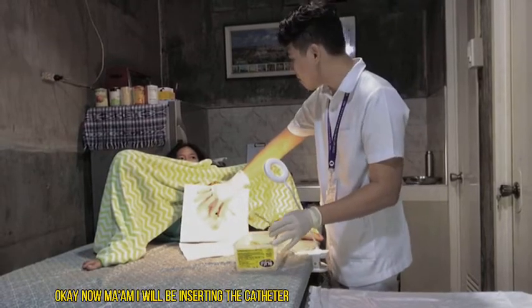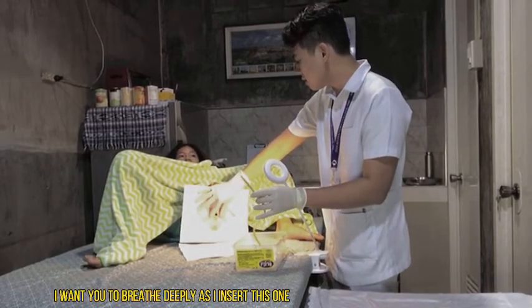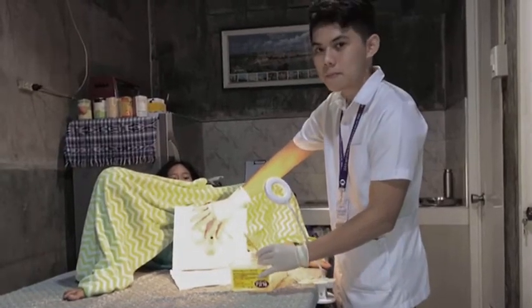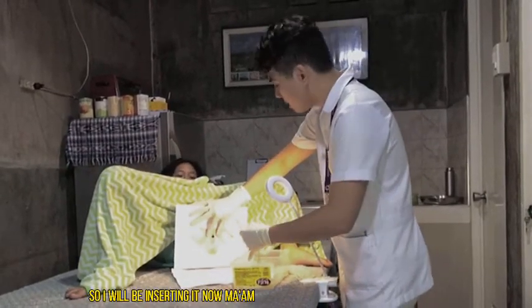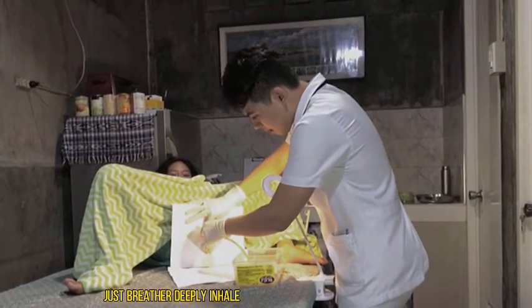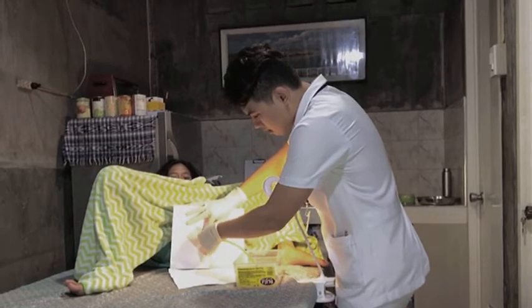Okay, now, ma'am, I will be inserting the catheter. I want you to deep breathe as I insert this one, okay? So I will be inserting it now, ma'am. Just deep, briefly, inhale. Exhale.